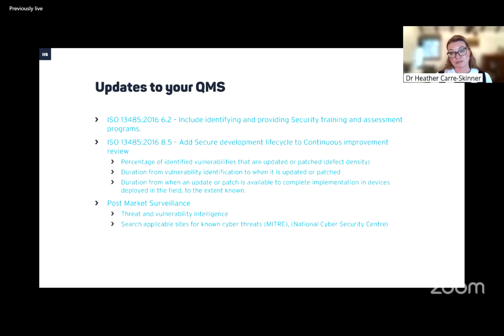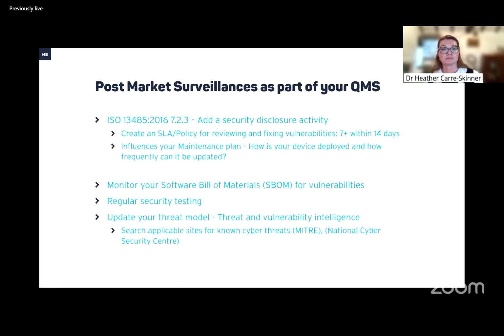And as we mentioned, post-market surveillance, really honing in on threat and vulnerability intelligence and what that means to your device. So have a look at websites which detail cyber threats such as CISA and the National Cybersecurity Centre. And just to finish, I think most of that's covered actually.